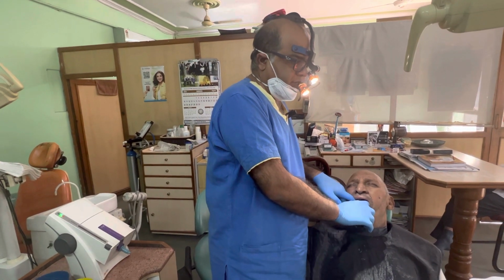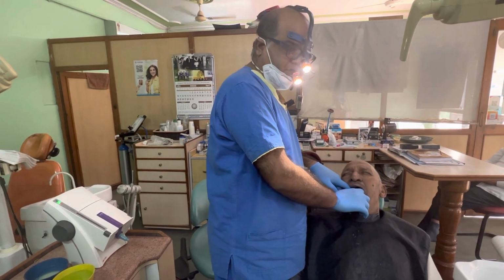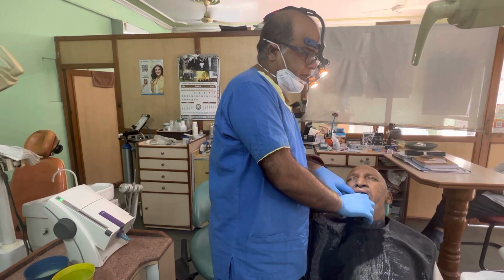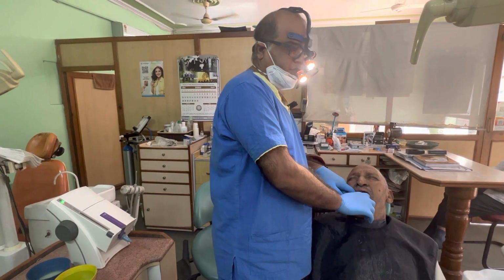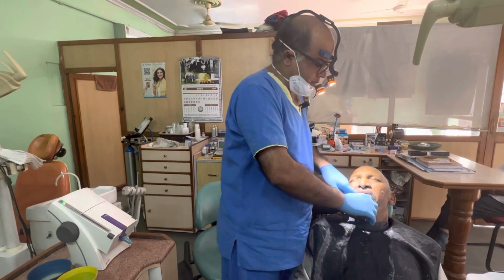Fourth important thing is sharp edges. Sharp edges over the tooth, you have to make them rounded. Okay, very important. You have to remove the undercuts, because if undercuts or any tilting is there, then it is very difficult to place the guiding appliances.